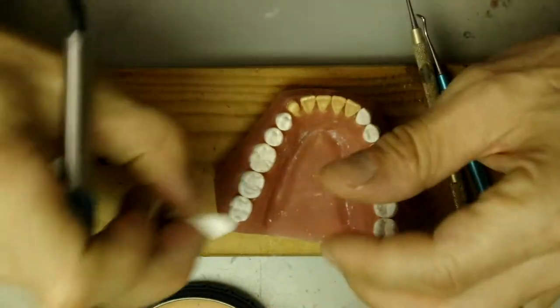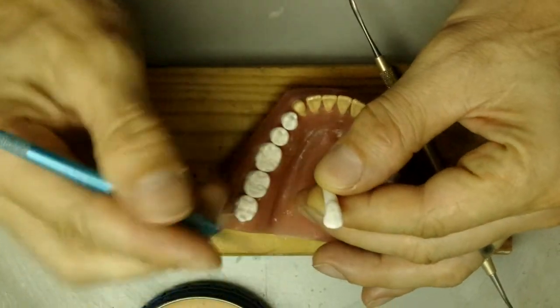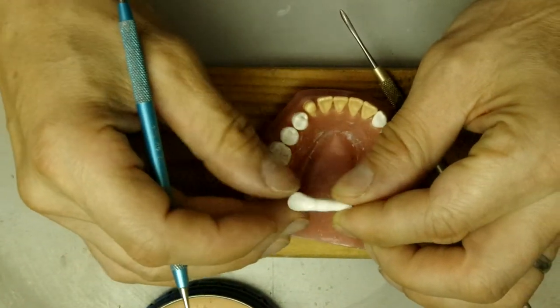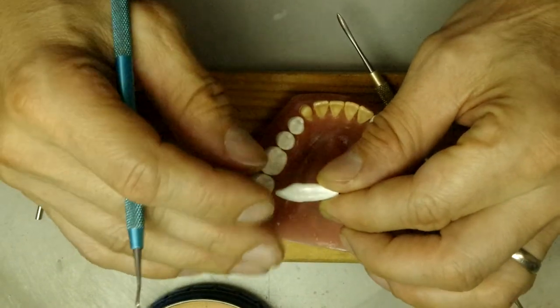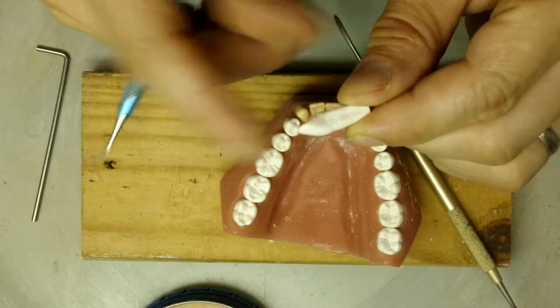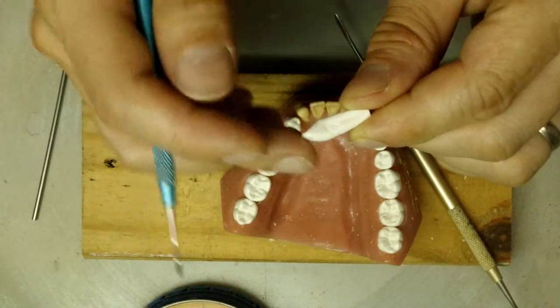So if we take a look at this tooth, the crown of the tooth itself is wider mesiodistally, right? You look at it from the front, from the side. This is the distal view. I don't know if you can see it from all this light. Let's go a little closer. You see the curvature here? This is very important. So when you're waxing it up, just take this tooth out and take a look at the curvature.